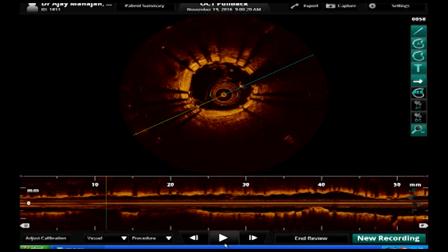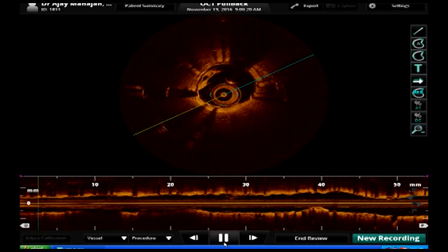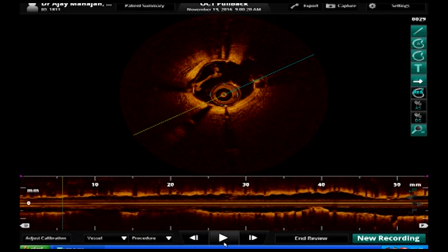Ajay, the question is, can we see the distal edge? Do you feel comfortable with the distal edge on angiogram? And on OCT, we don't see the distal edge yet. Distal edge, I am planning to just re-image after post-dilatation. The plan is distal post-dilatation with 2.75. So this is a 2.75, just keeping inside. And then we'll proximally post-dilate with a 3.